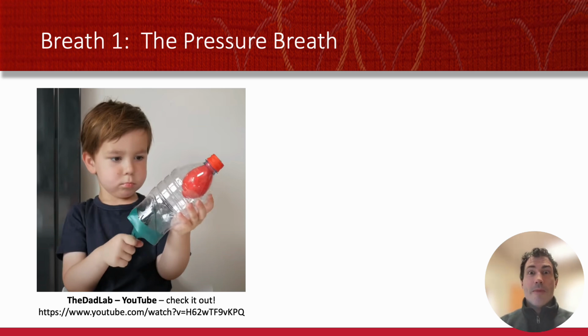And it also reminds me always of the old experiment we did in elementary school where you cut a 2-liter soda bottle in half, hook a balloon up to the inside, and then tape a balloon to the bottom. And you see that both positive pressure, inflating the balloon with your mouth from the top, and negative pressure, pulling the balloon down on the bottom, will inflate that middle balloon. That's really similar to a pressure mode of ventilation where instead of using our diaphragm to pull the balloon down and inflate the lung, we're using positive pressure to inflate the lung.